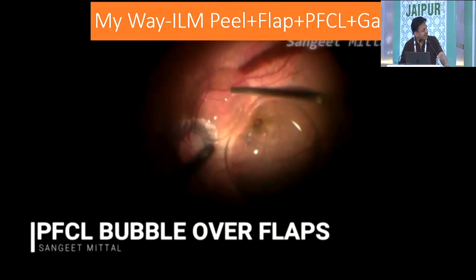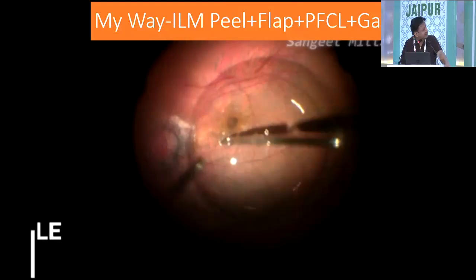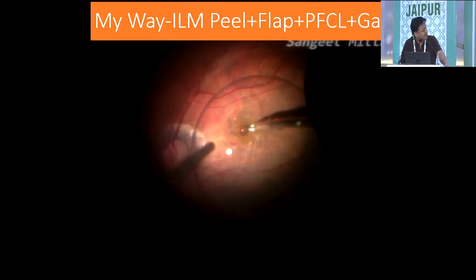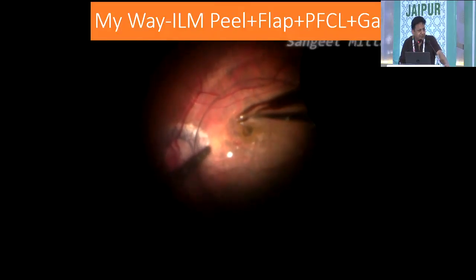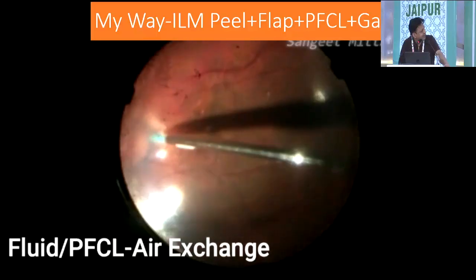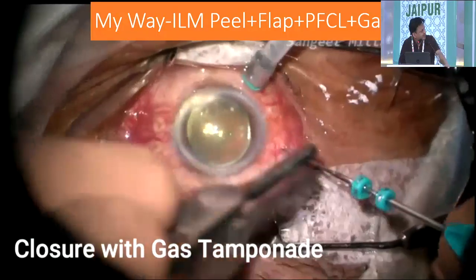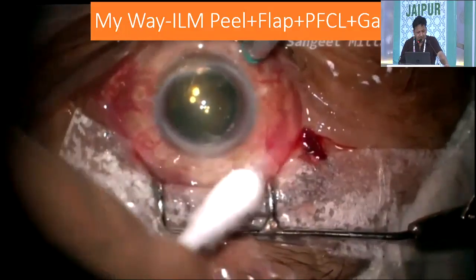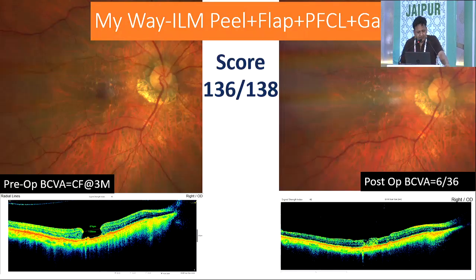After raising the ILM flaps, they are stabilized and inverted under the PFCL bubble. Fluid air exchange is done and gas is used as a tamponade. And this was like the post-op, and almost like 138 cases in the past few years, almost 100% closure rate I got doing this procedure.